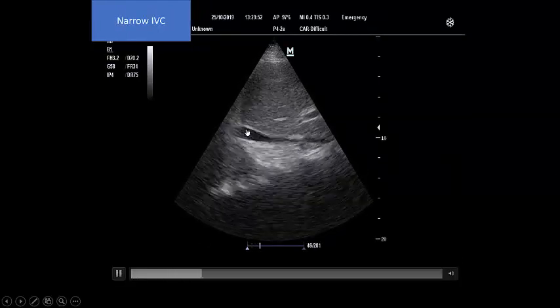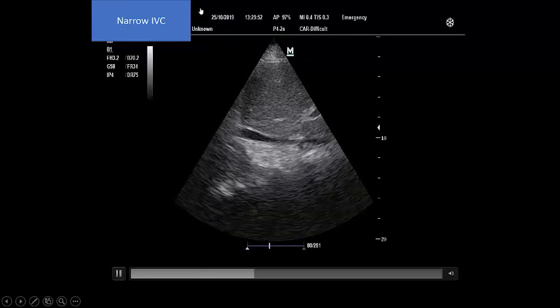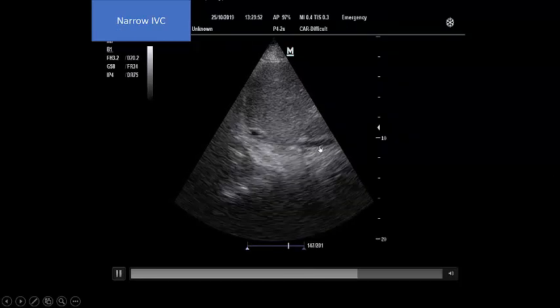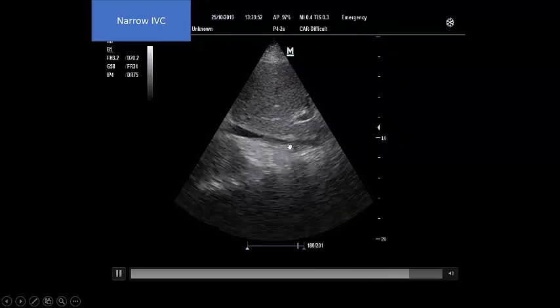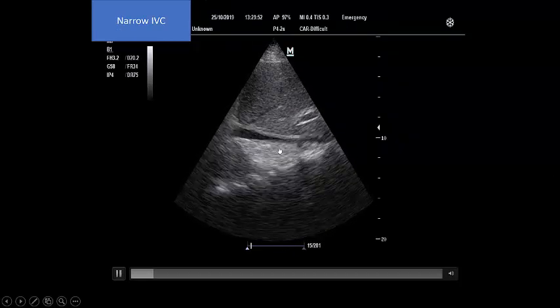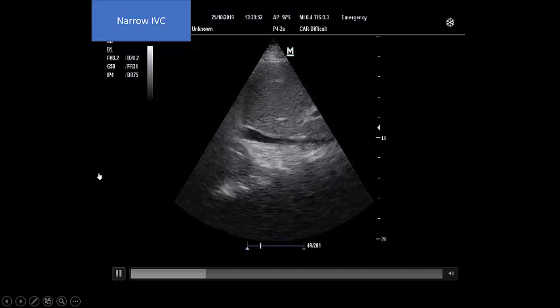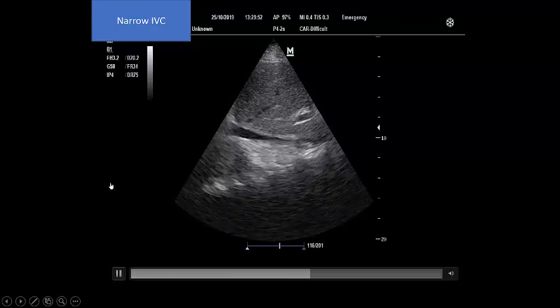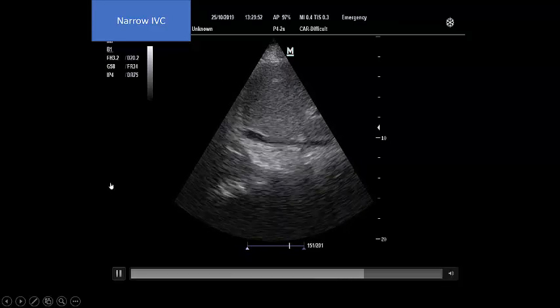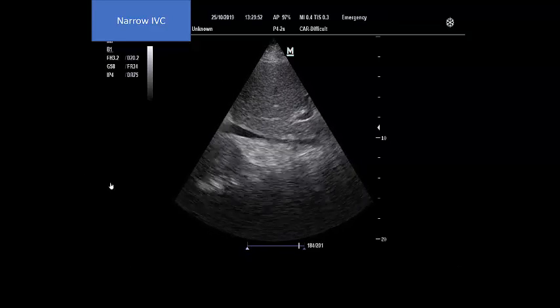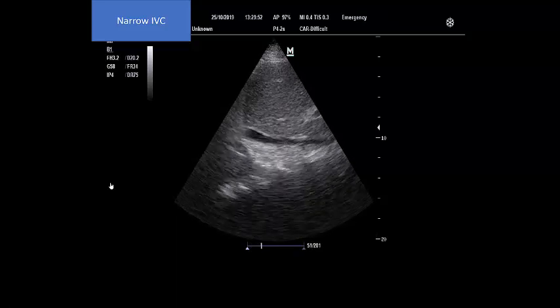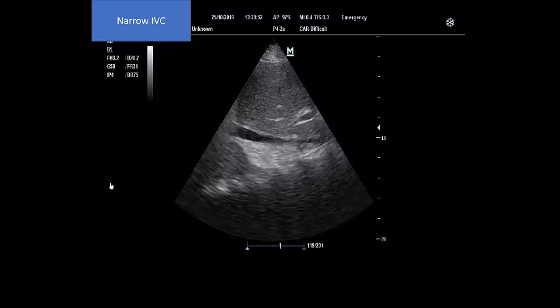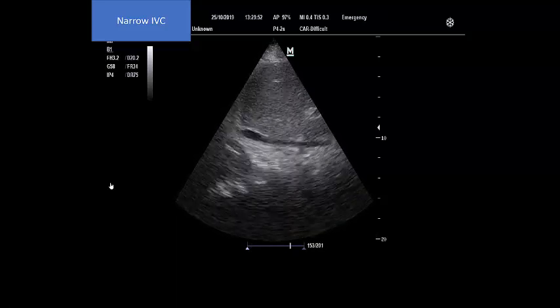However, looking at the inferior vena cava of our patient at the same time, it is very narrow and totally collapsing. This alerts you that something else is going on — but then why is the right side dilated?